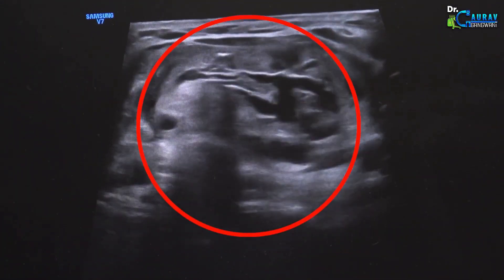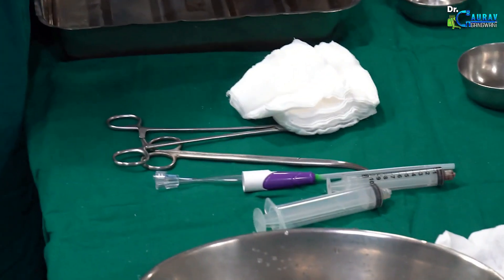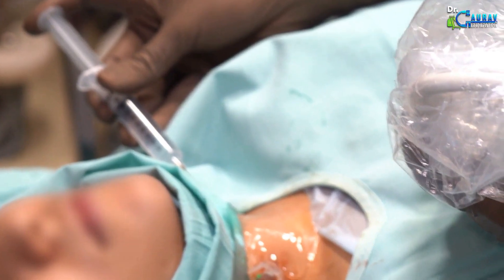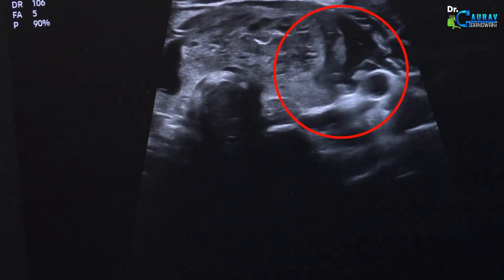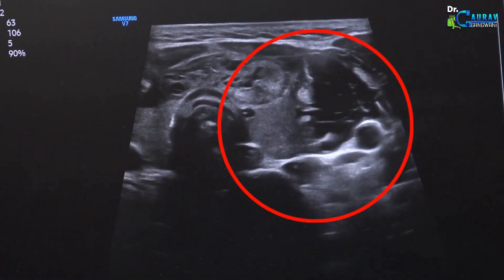Now that all the water has been completely drained, our team will open a new pack which includes the antenna, its copper cable, the connected cold saline pack, tubings, and prepare them. First, local anesthesia will be administered, followed by hydrodissection, which will push the nodule away from the surrounding critical structures. This is to ensure that when we perform the ablation, there is no risk of damaging any nearby structures due to heat.